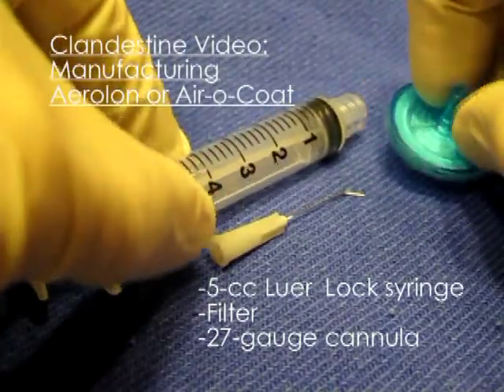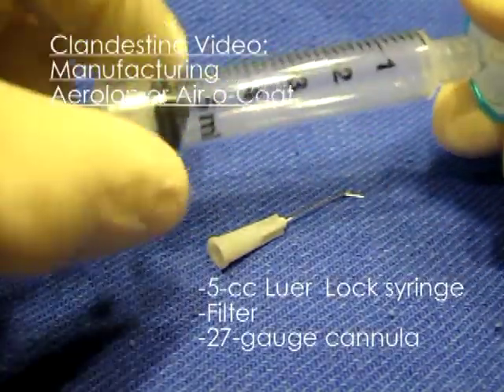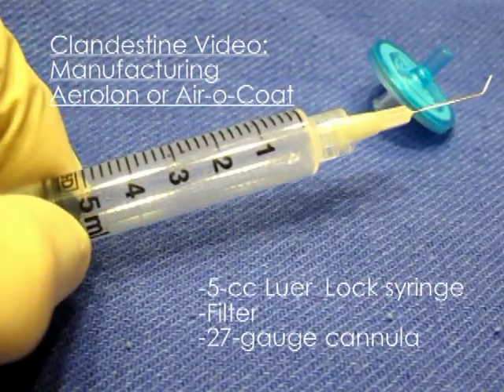I will let you in on a little secret. I obtained this video directly from the manufacturing facility. I don't remember if this was Aerolon or Aerocoat, but I was surprised to see it manufactured in such a simple fashion.